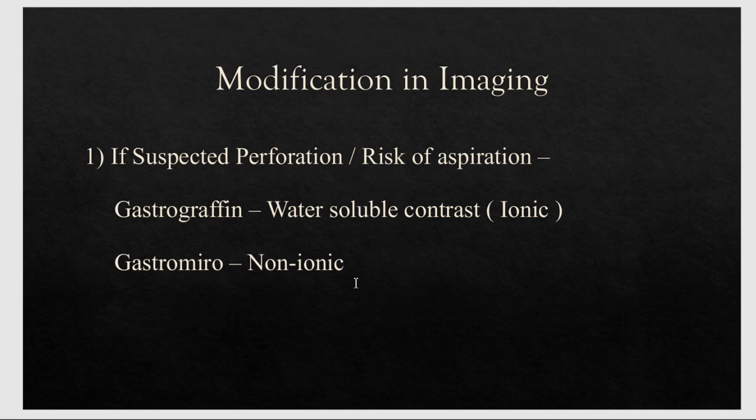Barium is very thick, very high density, and sometimes if the patient is going to aspirate during the barium study in this group of patients, it may reduce the function of the respiratory tracheobronchial passage, and sometimes in very rare instances it may lead to death also. So in this group of patients, don't use barium.